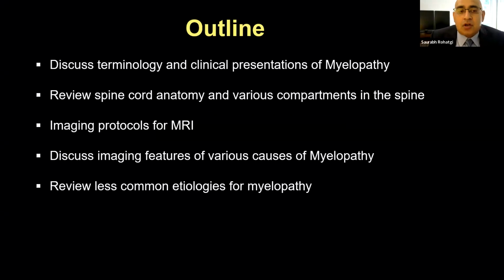So the outline of the talk is I'm going to talk about the terminology and clinical presentations of myelopathy, review spinal cord anatomy and various compartments in the spine, imaging protocols for MRI, and discuss the various causes of myelopathy and review less common etiologies of myelopathy.